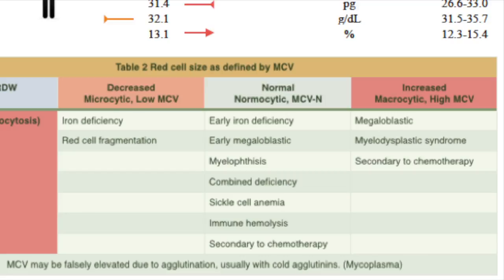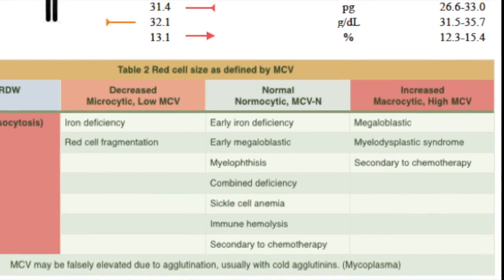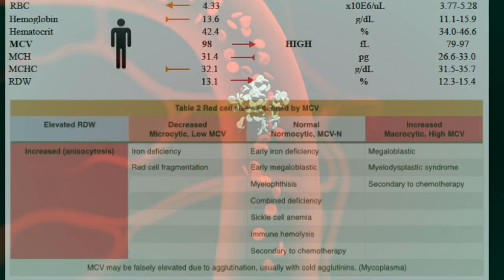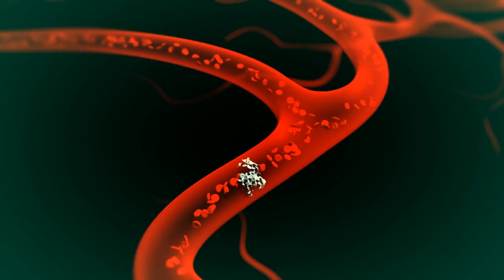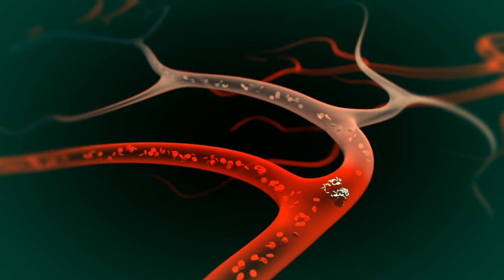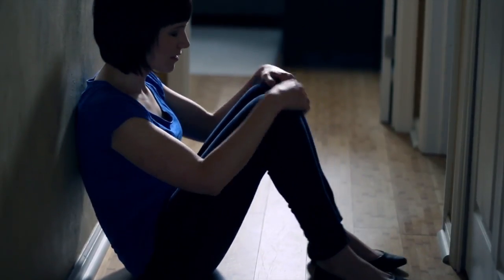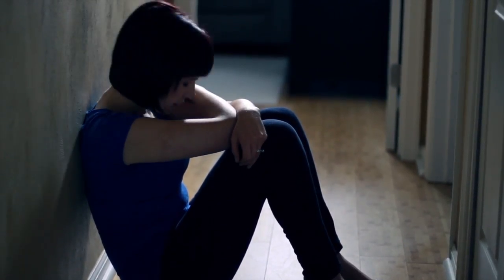Anisocytosis with normal MCV is associated with early iron, vitamin B12 or folate deficiencies, dimorphic anemias, sickle cell disease, chronic liver disease, myelodysplastic syndrome. Another possibility is that the body is attempting to compensate with the bone marrow working overtime and the indices appear normal. One should ask, does the patient's symptoms match the lab test? If they do not, this is something to consider.